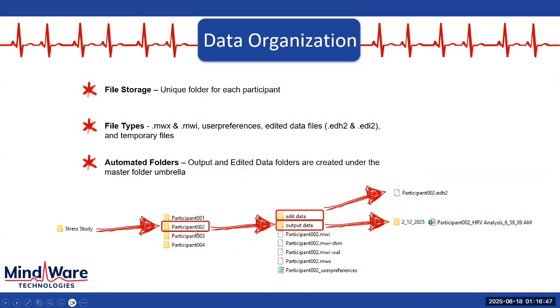When we actually acquire the data, we're going to place the MWI and MWX files into that folder. In addition, when we export the data to our output file, which is an XLSX Excel file, this folder is created by our software and placed underneath that.